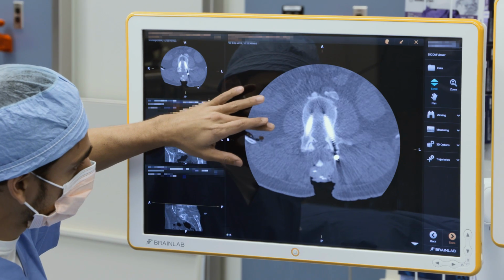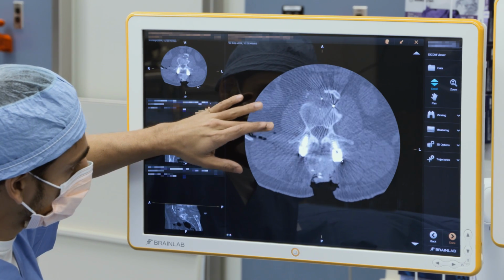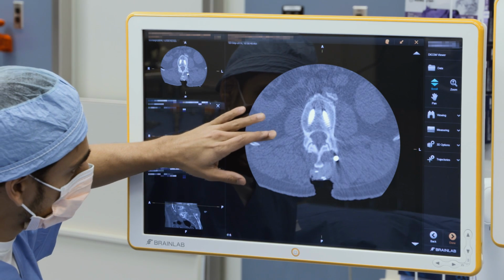Then generally at the end of the case, I'll take an x-ray showing the position of the screws, but I will not rescan. If anywhere along the line I'm concerned about any of the screws, then I will rescan at the end. When I do rescan, I usually rescan at 10 to 20% less than what the original scan was.